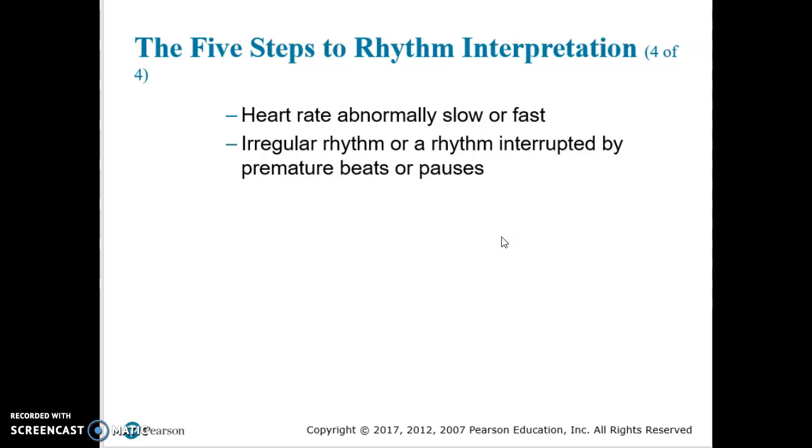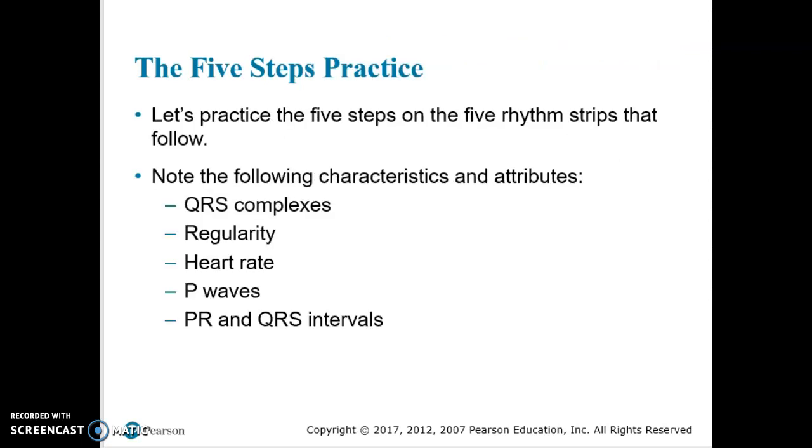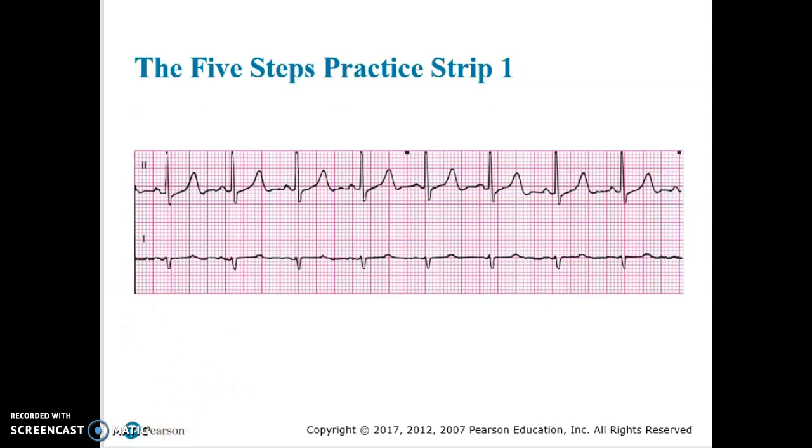When a patient has a rhythm change, you should assess your patient first. So if you're looking at this EKG strip and you notice a change, always go check your patient first. Don't just assume that this patient is in a lethal rhythm. It could be something happened. It could be a technical error. So always be sure to go and check your patient. This is something for you to pay attention to, characteristics for you to note, but we're going to go over and work on some practice strips, and I'm going to help you diagnose these.